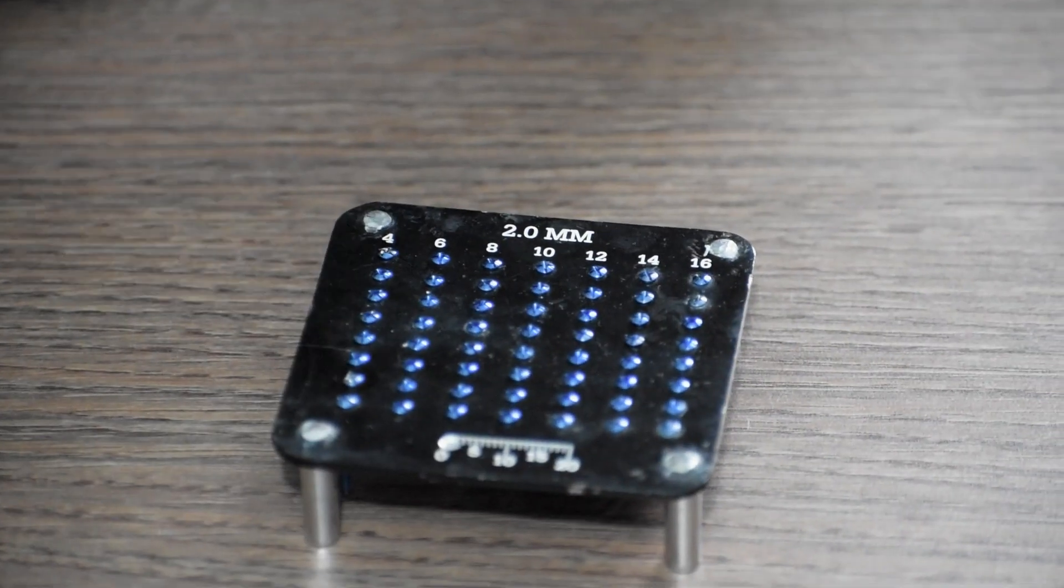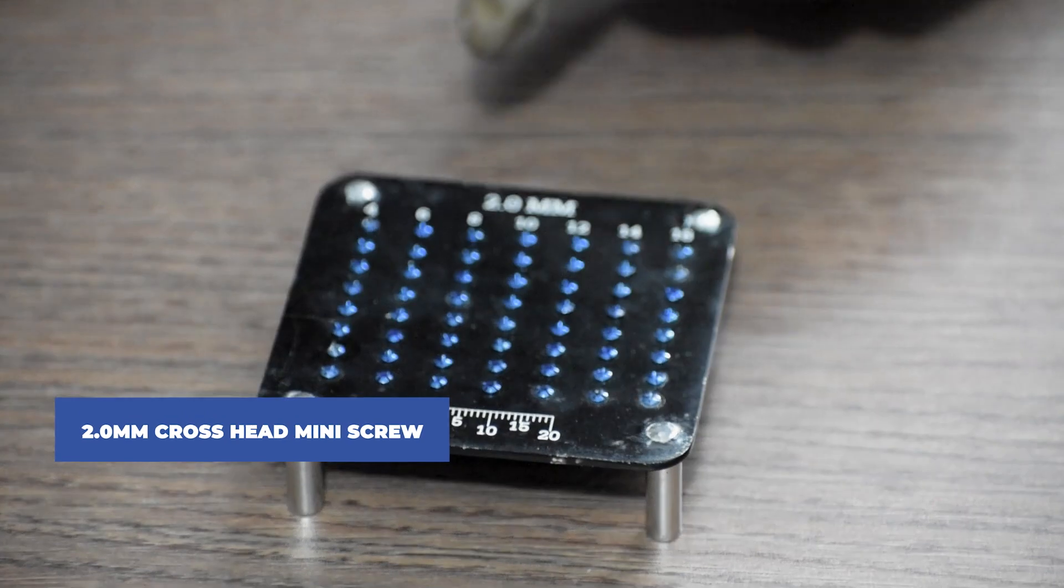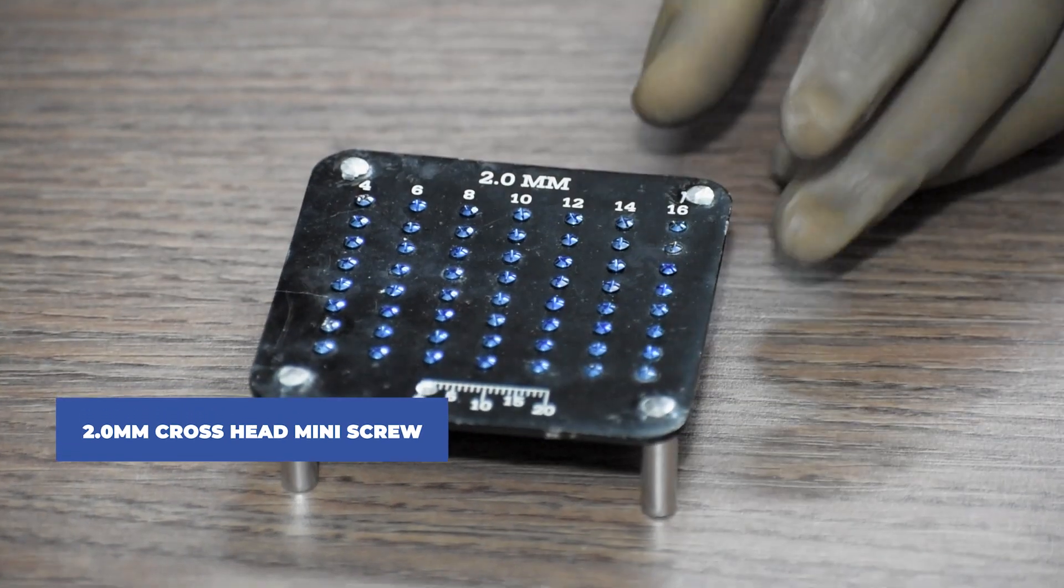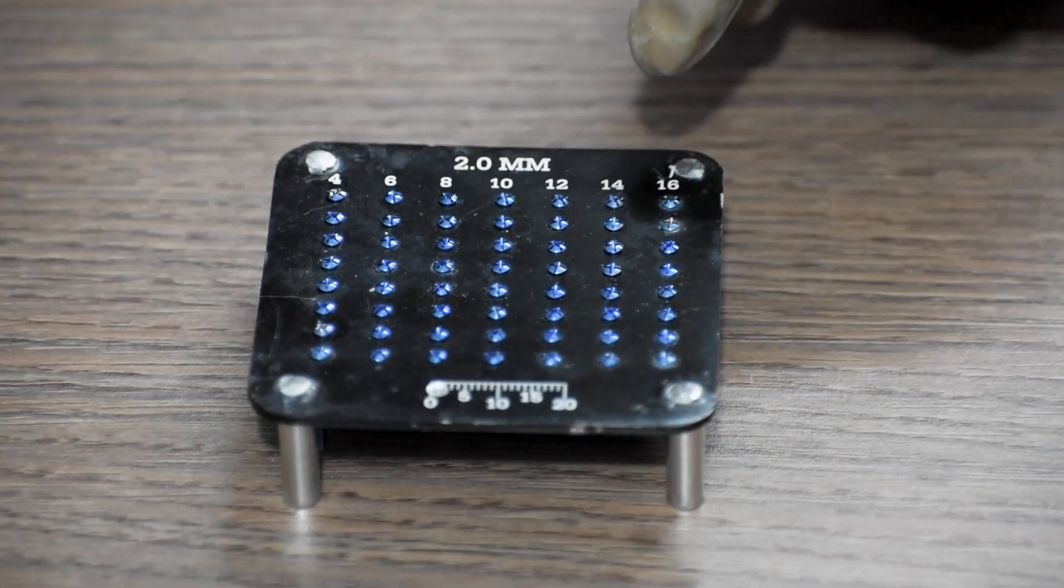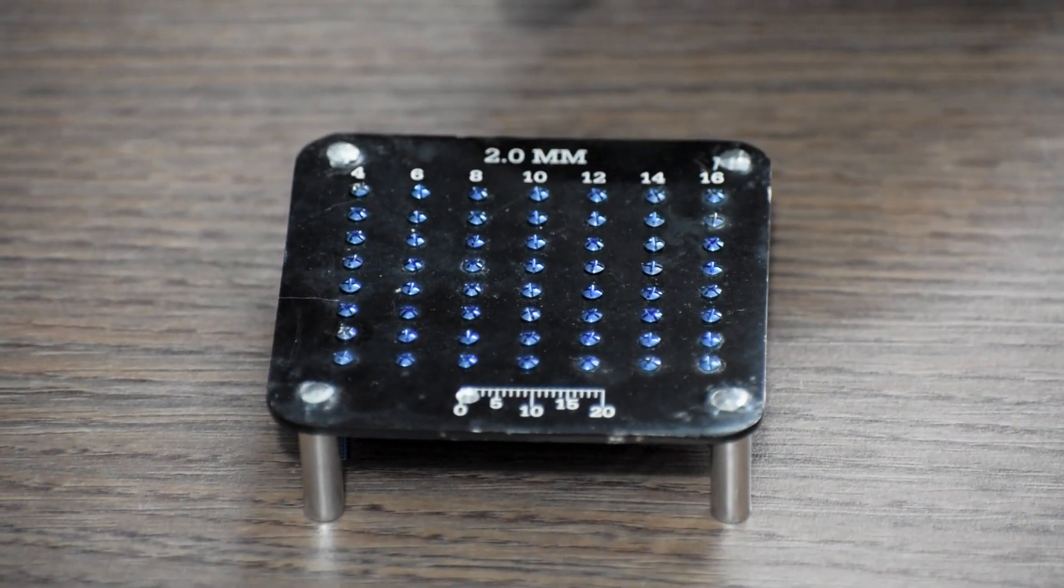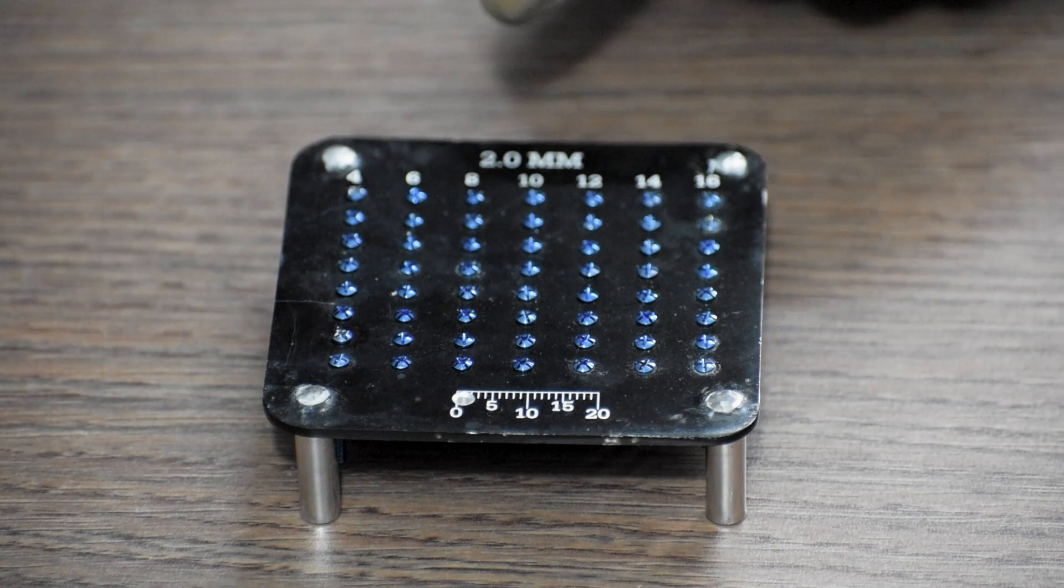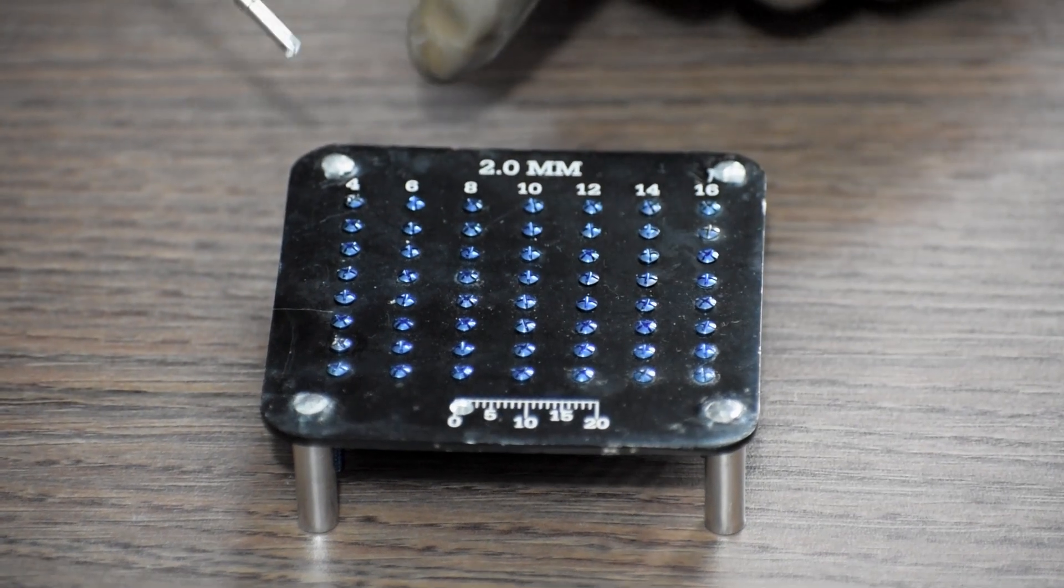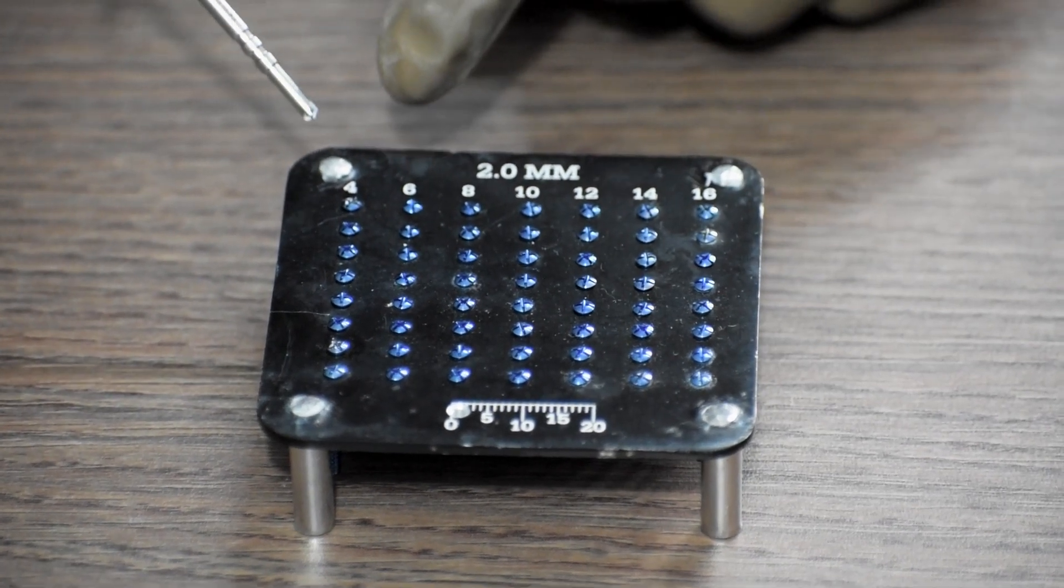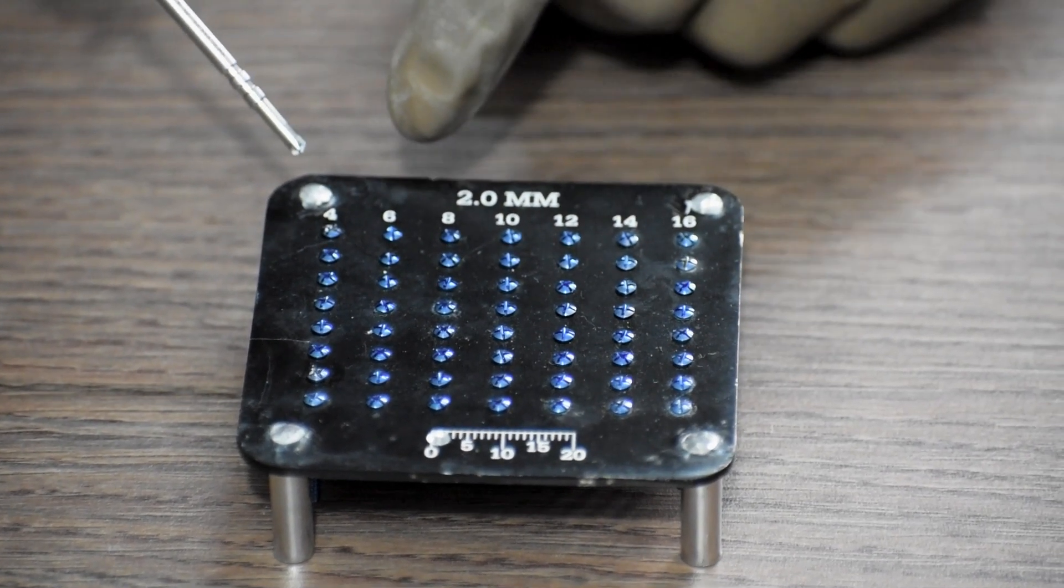Coming down to the screws, we will require 2 mm cross-headed mini screws. The length of the screws provided is from 4 mm to 16 mm.